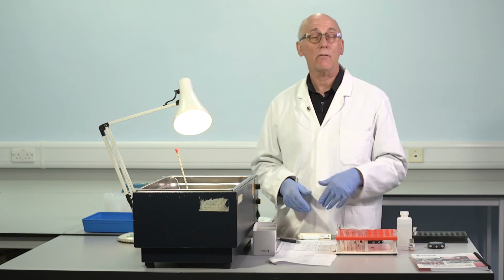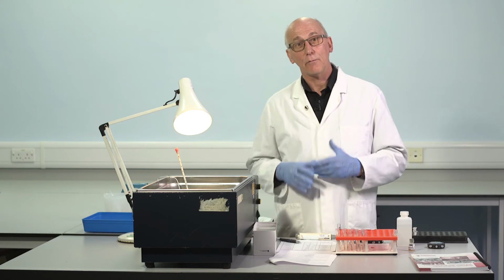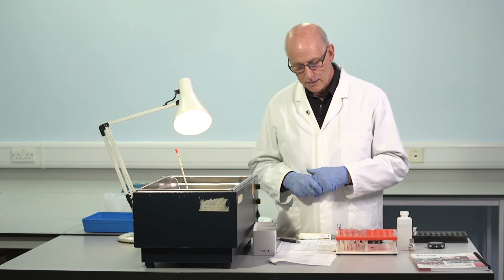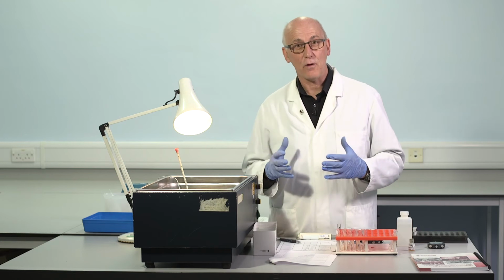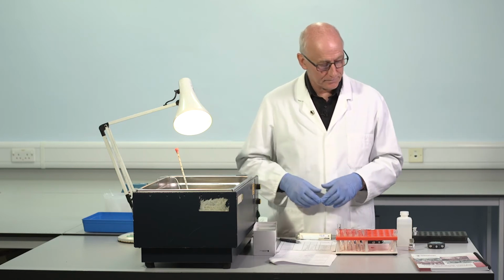Incoagulable? No. Does it clot? Yes. 90, 100, 110 seconds maybe. And it's the same here with this factor VIII deficient plasma. We will obtain a clotting time, and that's what we've done. So at this moment, for that patient, 140, 140, 140, we don't know what the level might be, and we'll look at this when we make the plot.